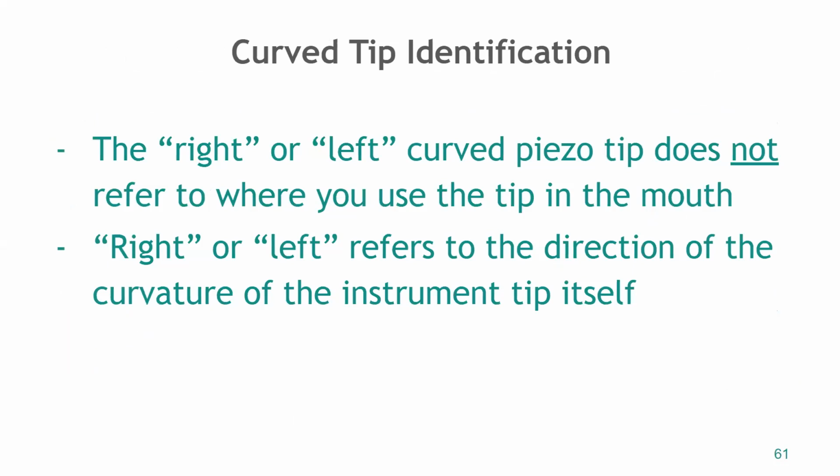So again, I'm going to show you guys these and it will just make a lot more sense when you see it in action. And like I said, the YouTube video that I posted also shows the curved tips. Some people loved the curved tips. Like I know Miss Larson, she really likes the curved tips. I'm not a huge curved tip person just because the way that I sequence, especially if I'm doing like upper right, lower right, like half mouth approach on a root planing, I feel like I have to change the tip the whole time, like I'm always going back and forth. So I prefer to use more of a universal tip, but again, everyone's going to have kind of their preference of what they feel like adapts best. And it's going to be different with each patient too.